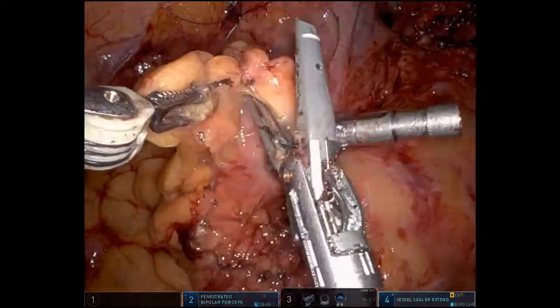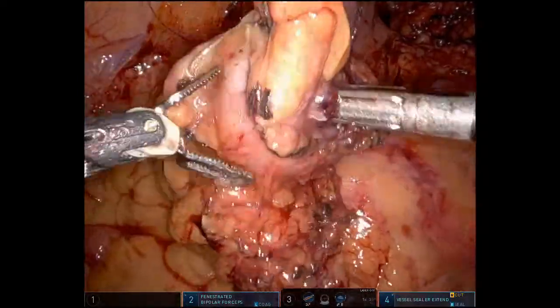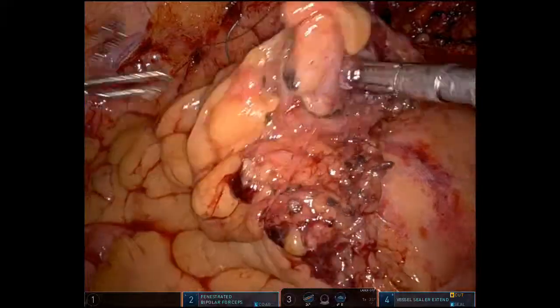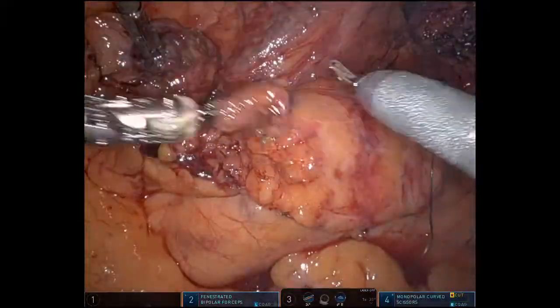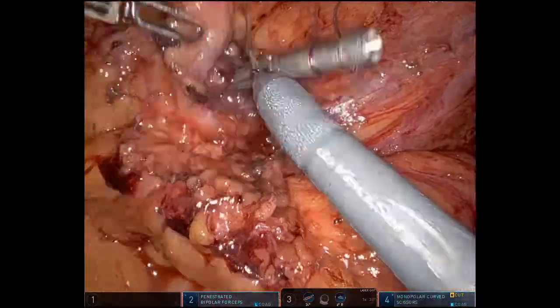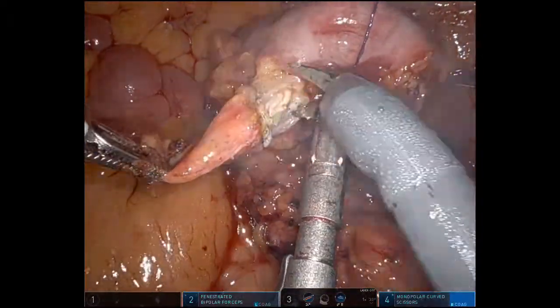So what we do in these cases is we dissect out the diverticulum very clearly — there it is right there. There's a smaller one right there. And then we simply take the scissor and cut it. So the smaller diverticulum is cut there. Here's the larger one — this would be right in the anastomosis, and I like to just cut it right out.